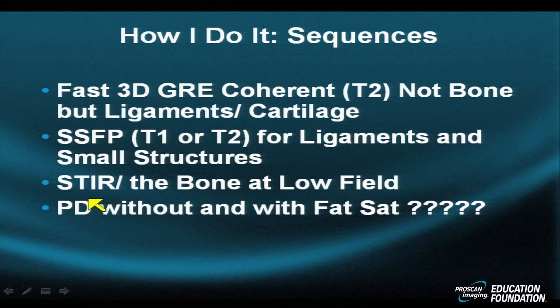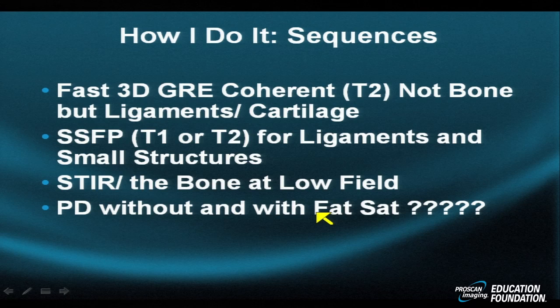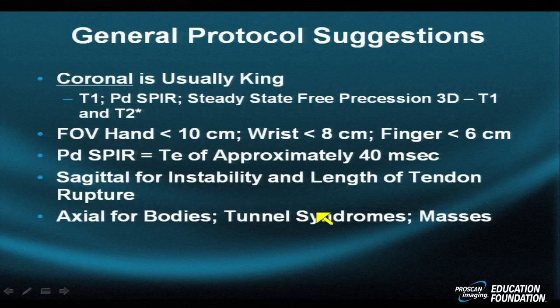The proton density image uses a long TR and short TE and is not commonly used alone in musculoskeletal MRI. However, when you take a proton density image — which has very high signal-to-noise and looks like a T1-weighted image — and apply a quality fat suppression sequence, you get the proton density fat suppression image, or PD SPIR. This transforms a sequence of limited standalone utility into one of the most valuable, versatile, and sensitive sequences in all of musculoskeletal MRI.